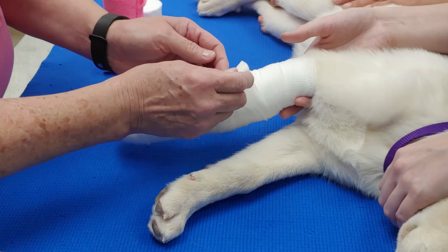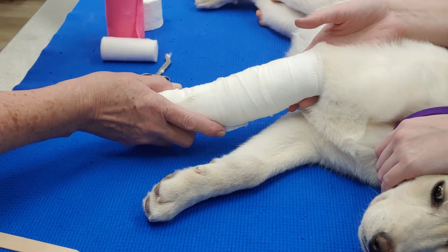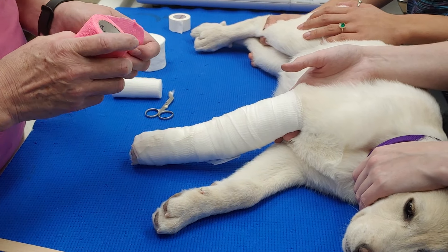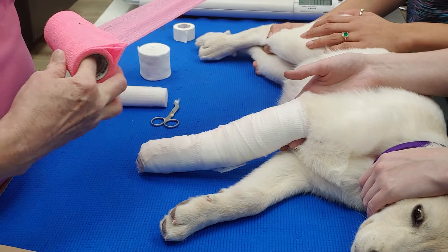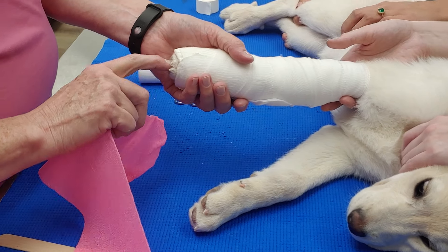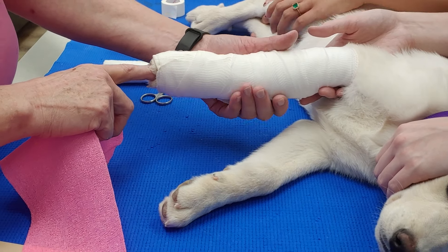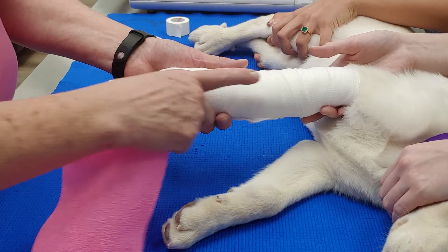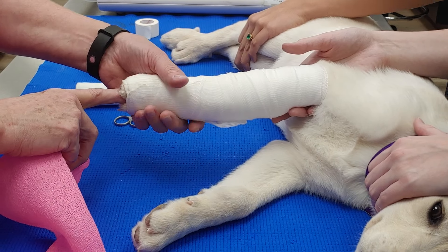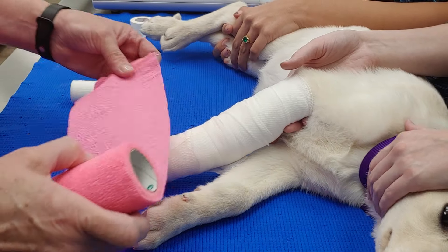This is a puppy and I'm sure they're very active, but it'll help reduce the amount of slippage. I like to take my vet wrap — we have a little female so she gets hot pink. I always leave a few toes out so that you can feel in between them. When the bandage may have slipped or shifted or be putting undue pressure on, if the toes aren't nice and warm, you need to take them in and get the bandage removed and reapplied. The toes should always be nice and warm, not swollen, and always at normal size.